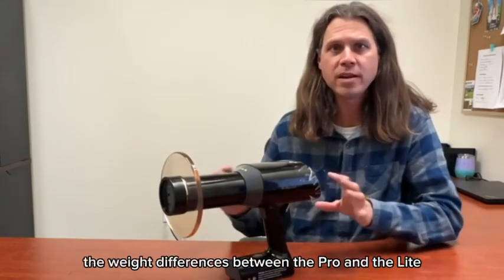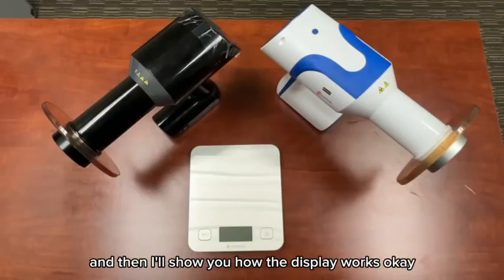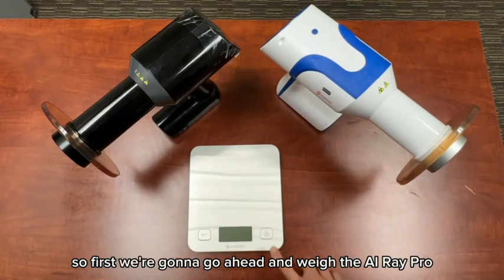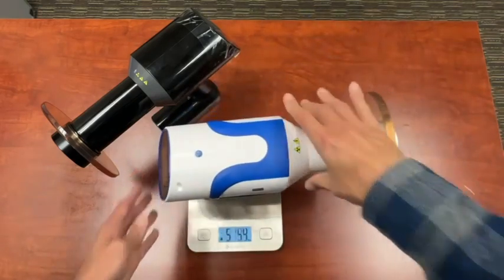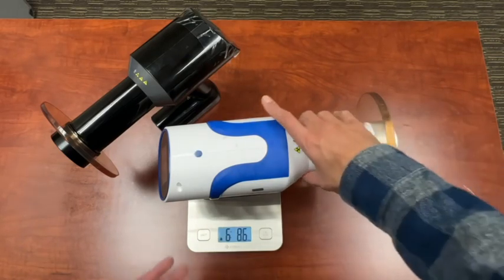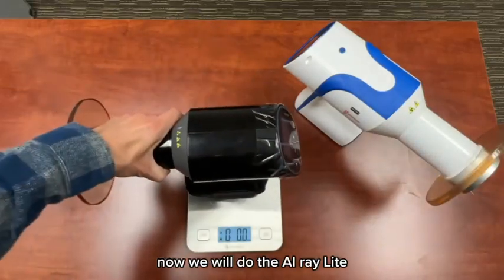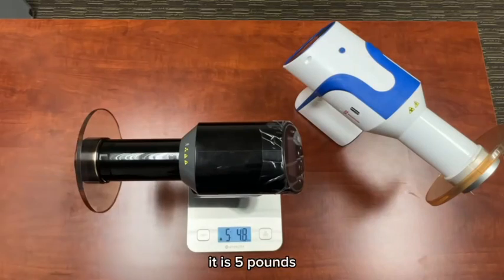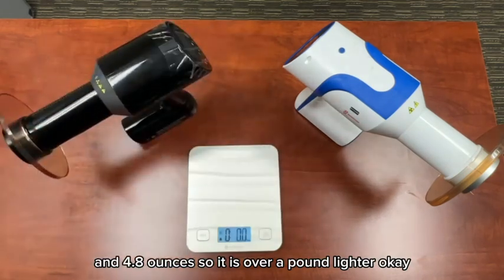So let's go ahead and dive into the weight differences between the Pro and the Lite, and then I'll show you how the display works. Okay, the moment of truth. First we're going to weigh the AI Ray Pro — it is six pounds 8.6 ounces. Now the AI Ray Lite — it is five pounds 4.8 ounces, so it is over a pound lighter.